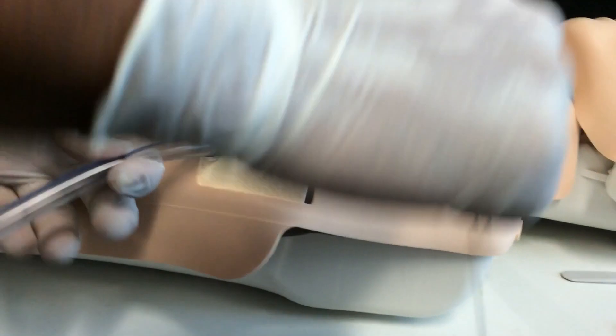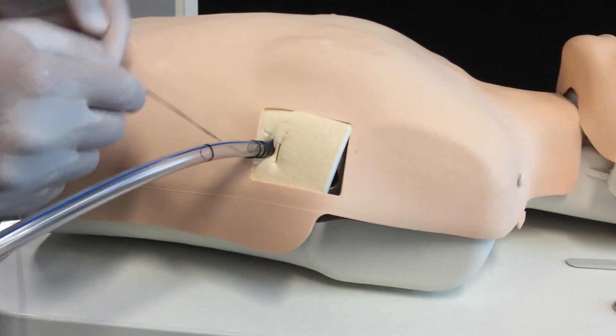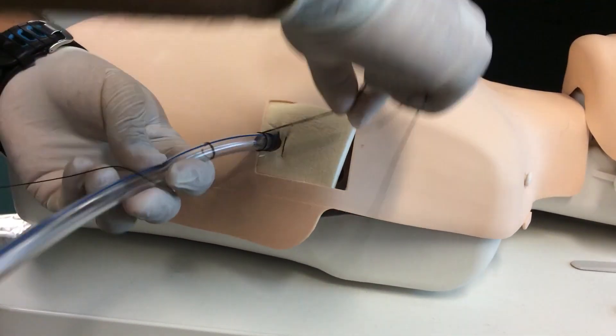Tie the knot in halfway and you wrap this tightly around the drain until the knot is at the drain.